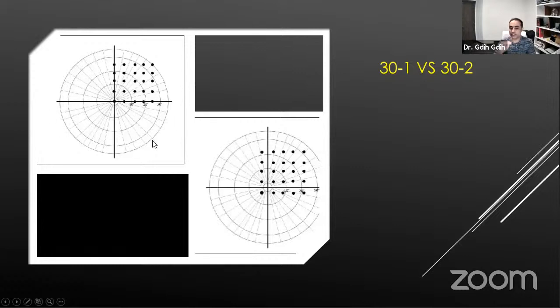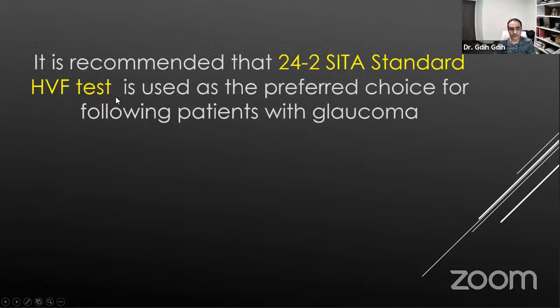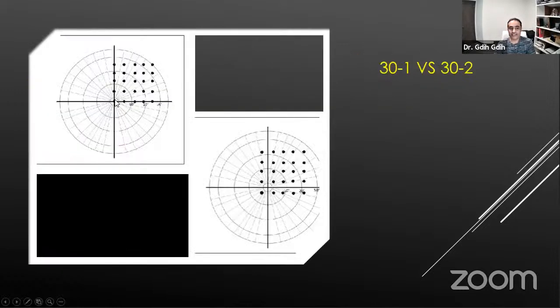It's important that the machine knows exactly where the midline is, and it knows that either by testing only 1 point at a time, at what the machine thinks is the midline.